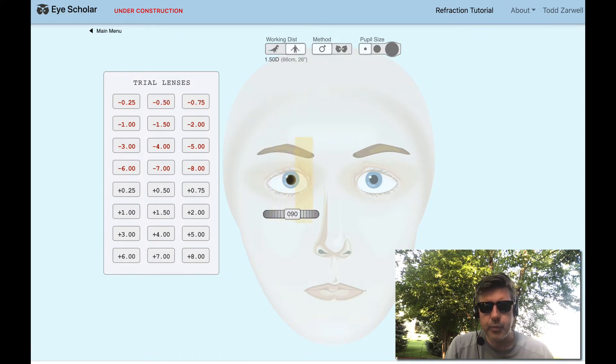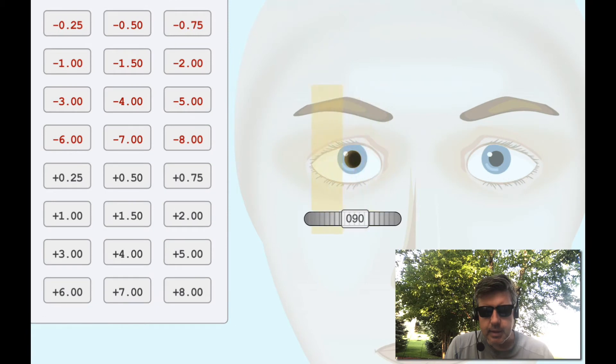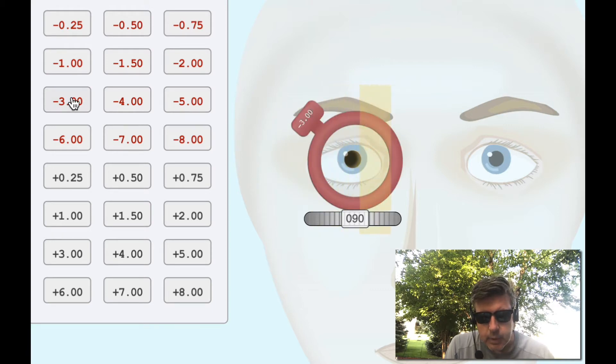When I look at this reflex, I really don't see much of anything. I think maybe I just get a hint of against motion and it's super dim, so I can't even see it. Let's just throw some minus in there. Okay, now I see something. Let's get even more minus in there — let's take the three out and put a five in there. Okay, now we're seeing something.